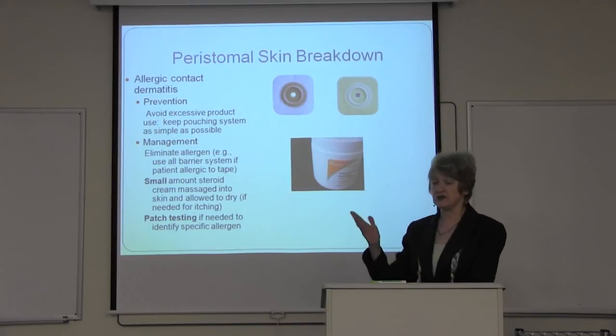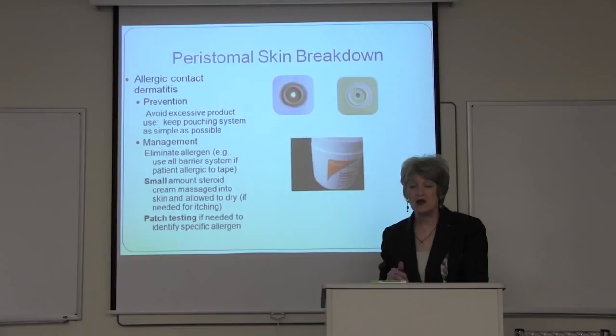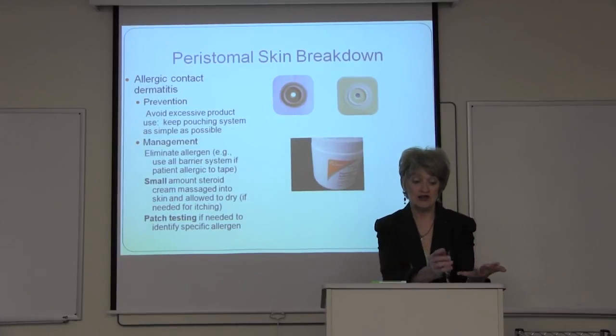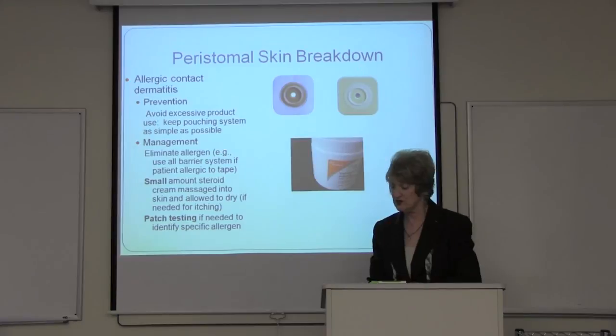And then if it's hard to figure out exactly what the patient's allergic to, if you're set up to do patch testing, that's fine. You have the guidelines in your course materials. But many times we'll end up working with a dermatologist and we'll say, look, I know the patient is reacting to this or this or this or this. Here are the commonly used tapes. Here are the sealants, et cetera, et cetera. And they'll help us with patch testing.